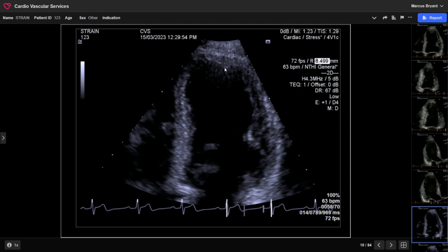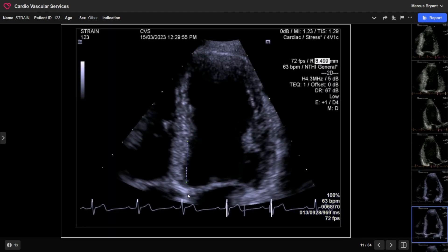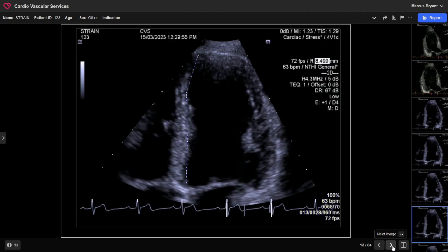Once I have an image, I'll scroll through until I can see the endocardium really quite clearly, and then I'll track from there. I'll put my first point down quite close to the mitral annulus, avoiding the valve but close to the annulus. There's limited documentation from Siemens about doing this, but it actually recommends using fewer points rather than an excessive number. I generally find seven works well - one on the base on either side, one on either side around the mid-basal junction, one around the basal-apical junction, and one at the apex.